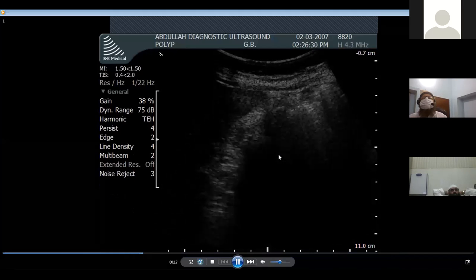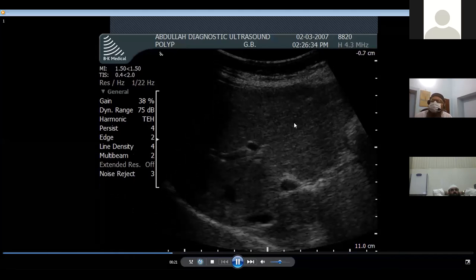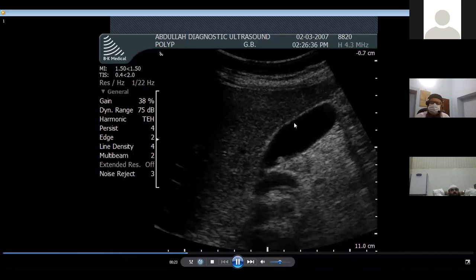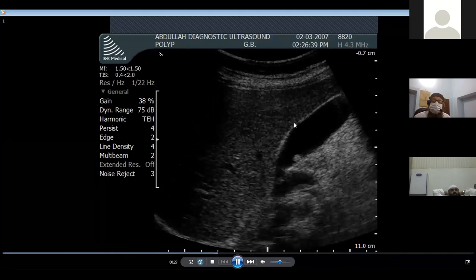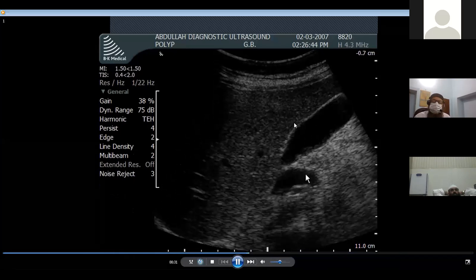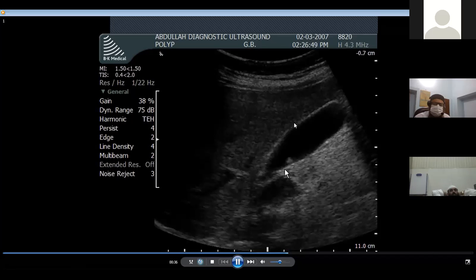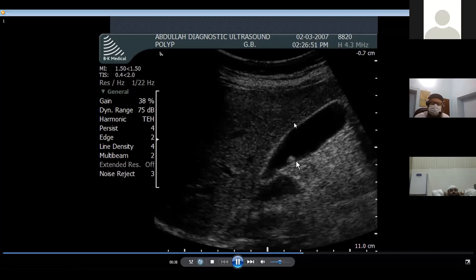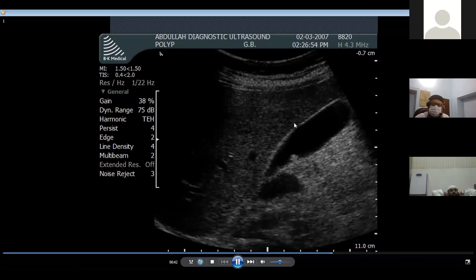We believe that gallbladder is one of those conveniently seen organs where ultrasound has totally replaced any other imaging modality like X-ray or CT or MR.